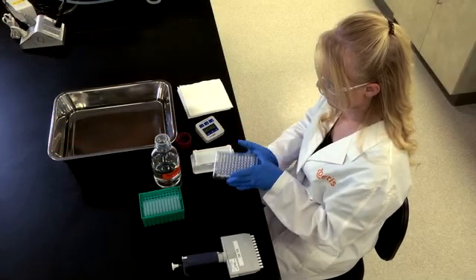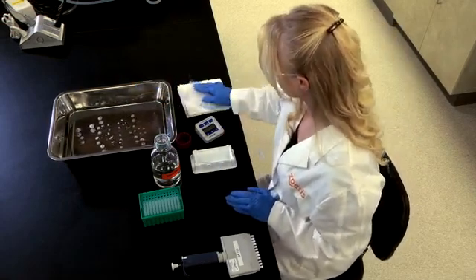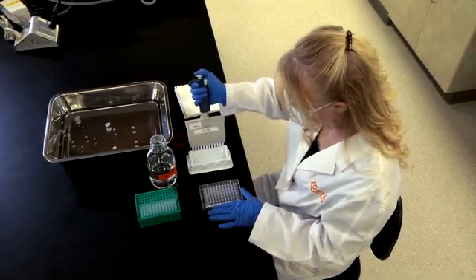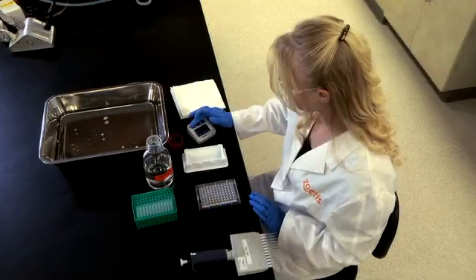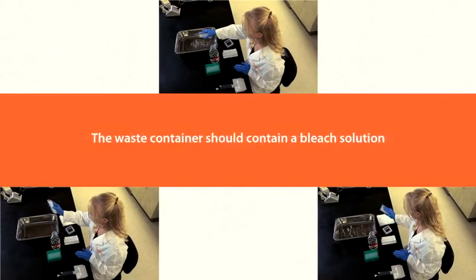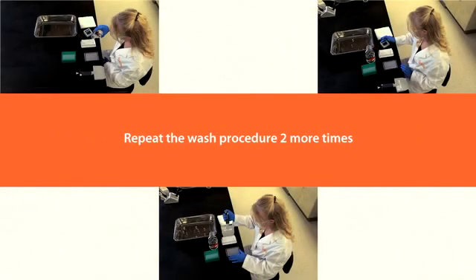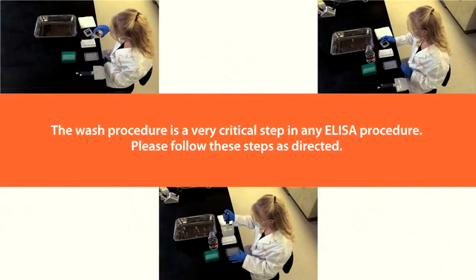Tap out liquid from each well into an appropriate vessel containing bleach or other decontamination agent. Using an 8- or 12-channel pipette or comparable automatic washing device, fill each well with approximately 300 microliters of wash solution. Allow the solution to soak for 3 minutes, then discard contents into an appropriate waste container containing bleach solution. Tap the inverted plate to remove all residual liquid. Repeat the wash procedure two more times. The wash procedure is a very critical step in any ELISA procedure; please follow these steps as directed.